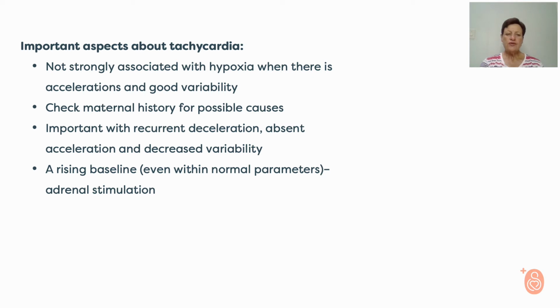And then it's also, like we've said on the previous slide, very important to check the maternal history for possible causes. For example, maternal pyrexia, medications that the mother is on, etc.